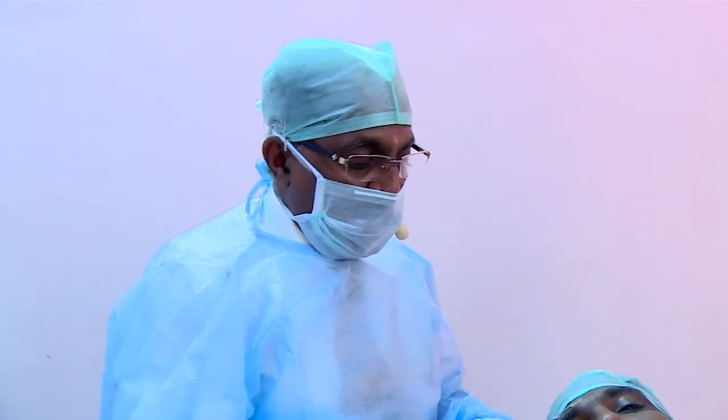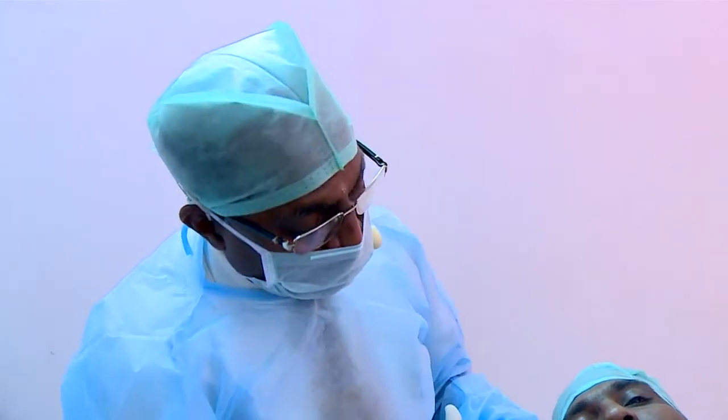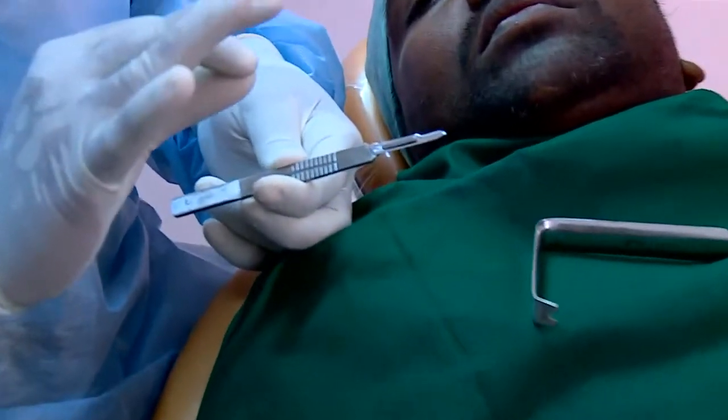That's one of the biggest advantages in dentistry. All of you are surgeons. You are all dental surgeons, so we can do suturing. You have made a flap. All you are going to do here is, as I see, this is a number 15 blade. If you can just focus on this. This is the most common blade which is used in oral and maxillofacial surgery, right?